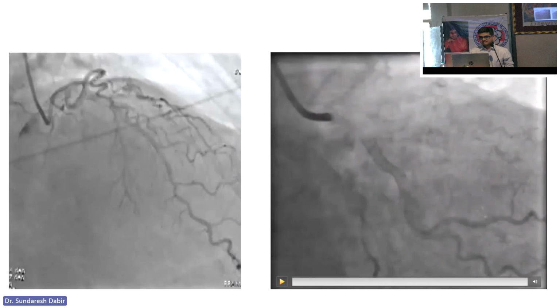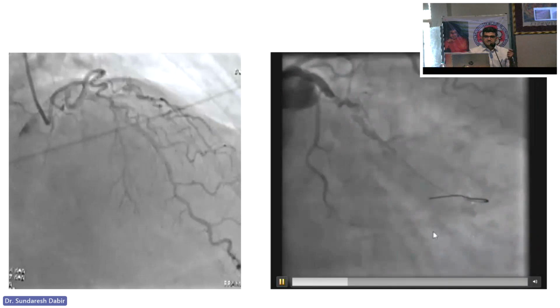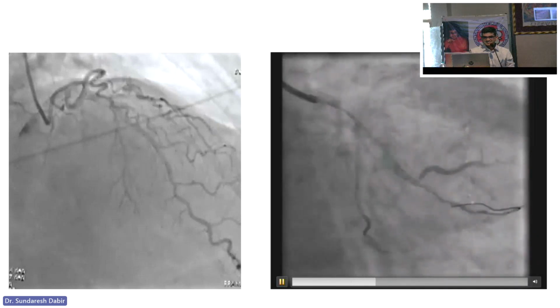And then those pseudo lesions come. They're actually all pseudo lesions. There's a wire, there's a tortuous vessel, now you get this. It's called a pseudo lesion. You don't have anything there. It's just like when we wire a bent or tortuous artery, the wire straightens out the artery.